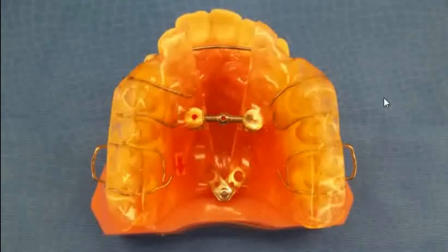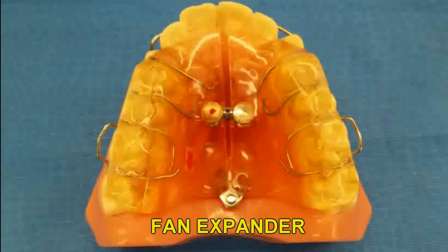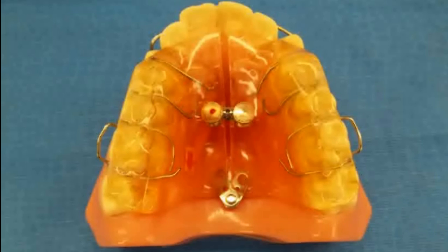As you can see from this photo, as the screw opens, the appliance opens in a V-shape and will expand the anterior region while maintaining the posterior region in the same width. The fan expander helps to uncrowd the teeth and create better arch form. It turns V-shaped or Gothic arches into good Roman rounded out arches.